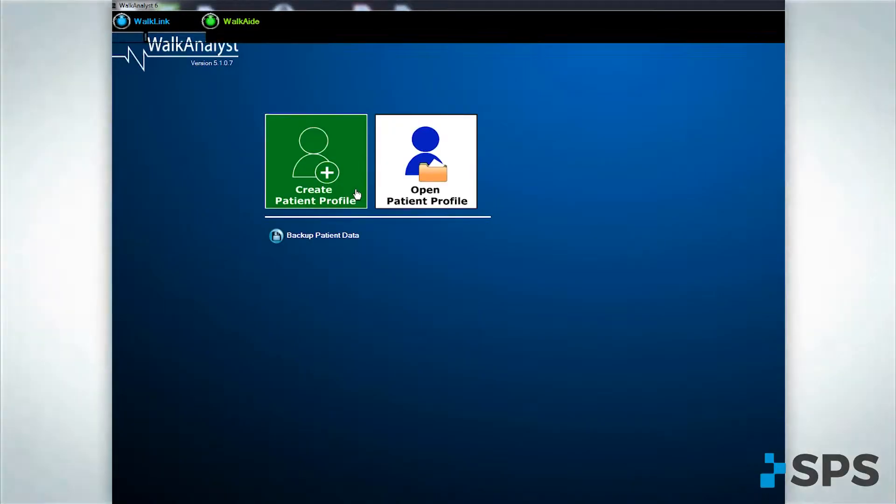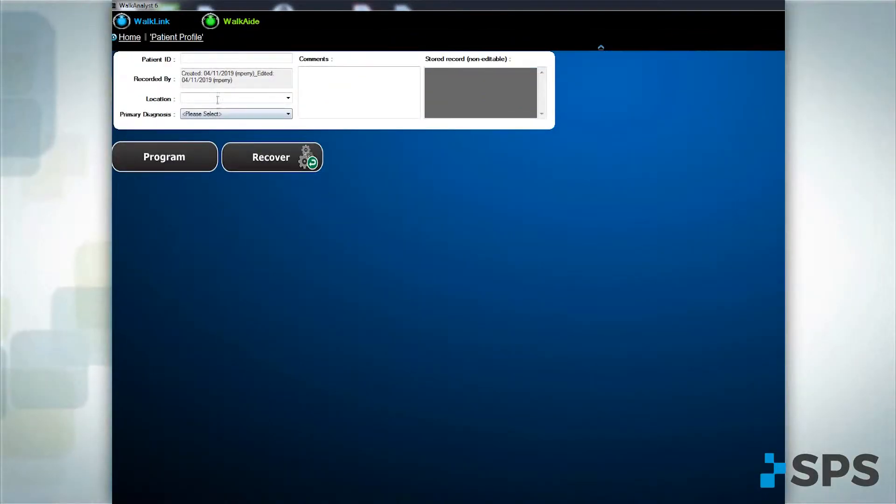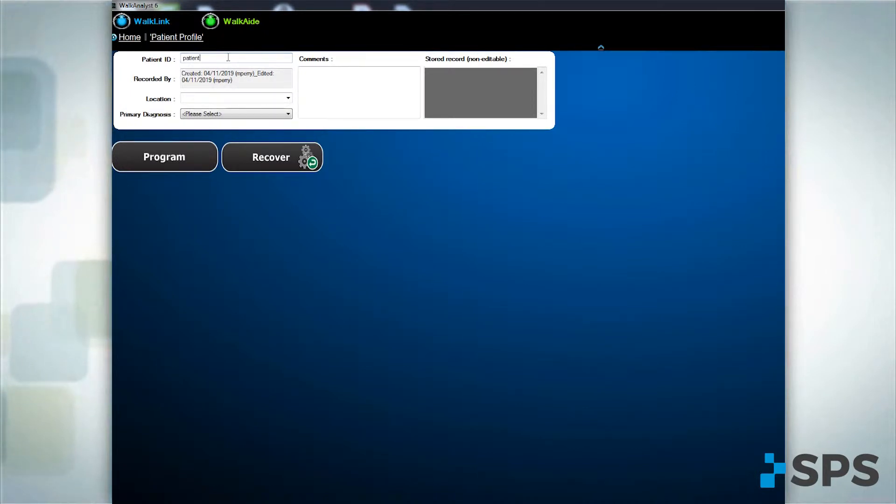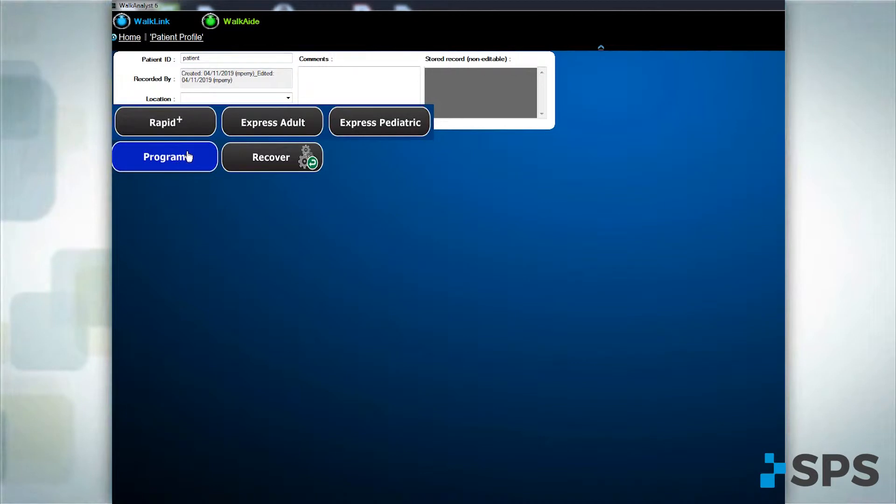Click on create a patient profile and enter his or her personal information. Select program then click on rapid plus programming.